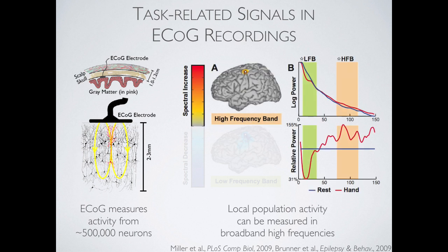And if we want to talk a little bit about the spectral properties, the signal processing, I said in the beginning with EEG, the scalp and the skull acts as a low-pass filter. It passes only low-frequency activity, and everything else it filters out, which means you've significantly truncated the usable information range available in EEG. With ECoG, you can look at the entire broad spectrum band of activity that you can detect above a population of cells.